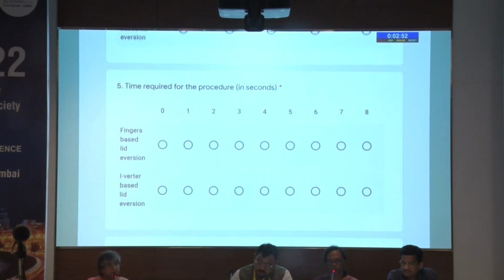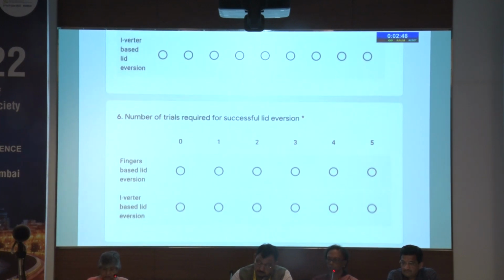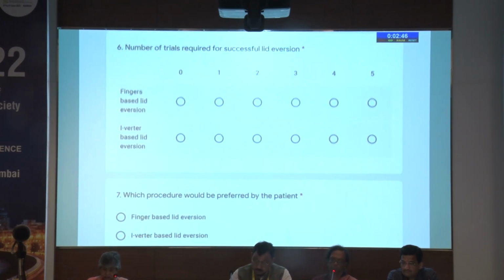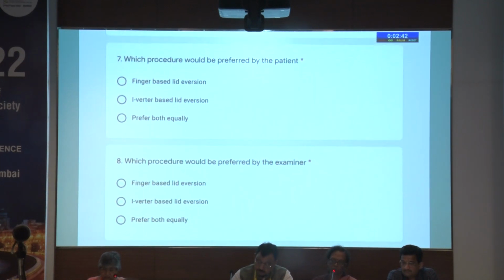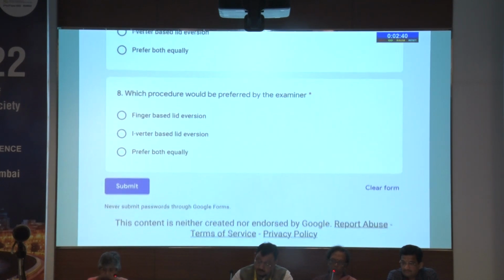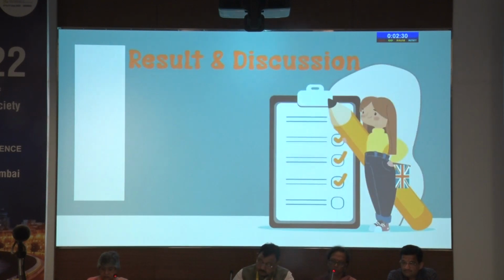The time required was recorded with the help of a stopwatch for both the methods, and the number of trials required for successful lid eversion was also recorded. We asked the patient and the examiner which would be the preferred method. A culture swab was taken from the fingertip after both the finger-based and the iVerter technique to assess the growth of microorganisms.